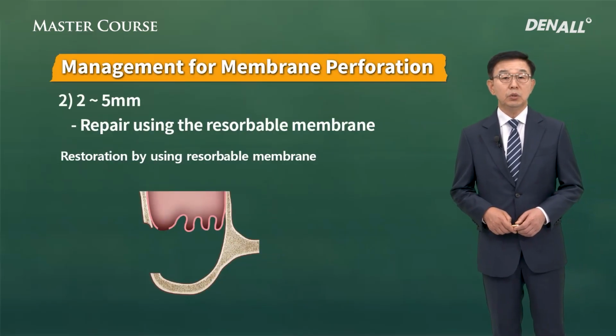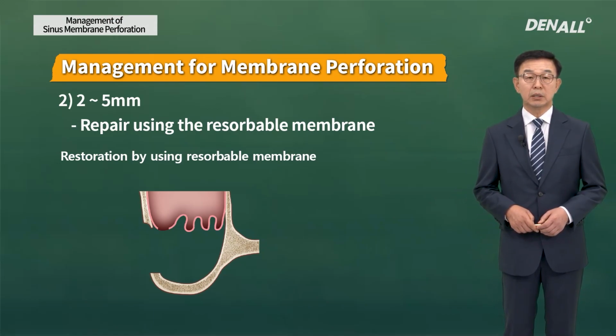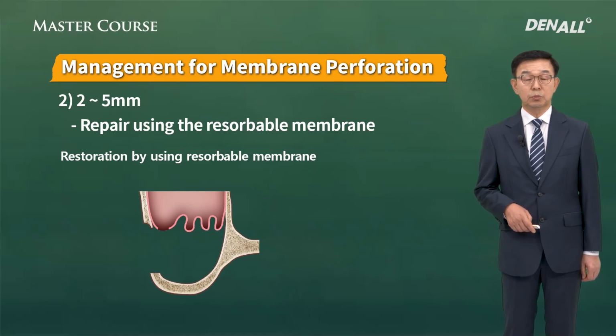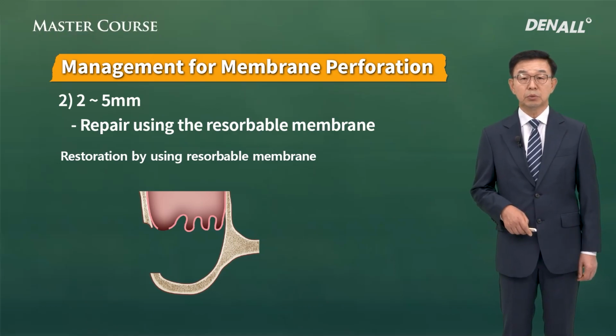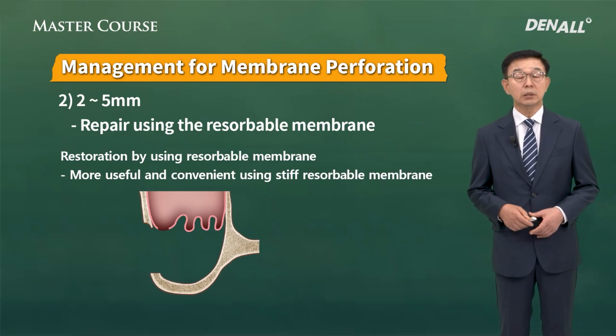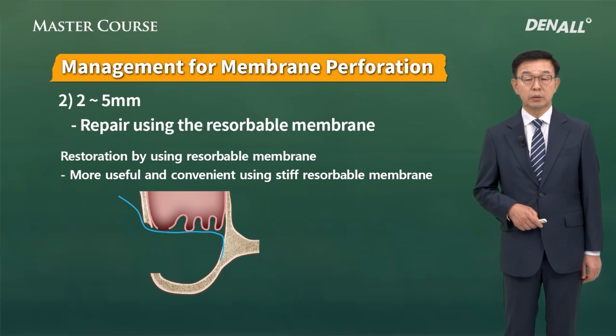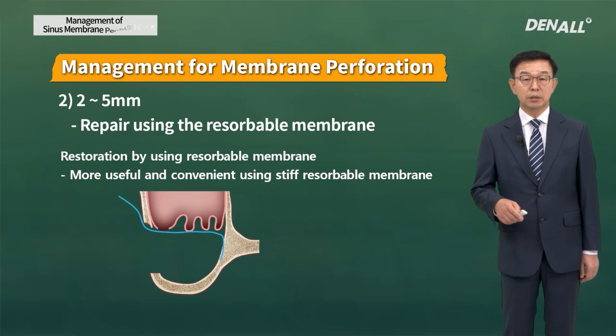Next, there's a case where the tear is about 2 to 5 millimeter. This is the most frequently experienced case clinically. You'll be able to restore easily using resorbable membrane in most cases. The resorbable membrane should be large so that it can extend beyond the torn area. And it is more favorable to use a stiff resorbable membrane. The resorbable membrane needs to cover an area beyond the torn area.